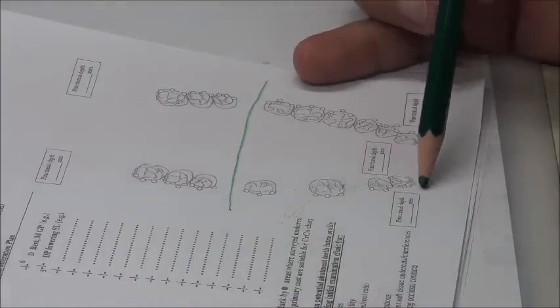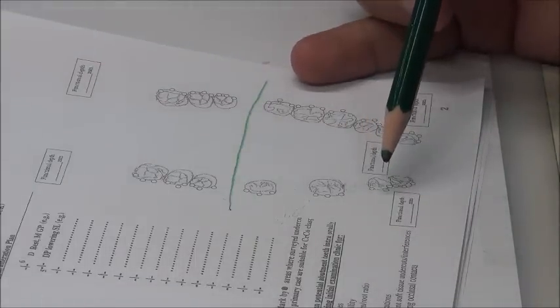Can I minimize components on this canine? I can. If the premolar is strong, I can eliminate even the clasps on the canine. But I could not eliminate the rests. Rest, I have to keep them.